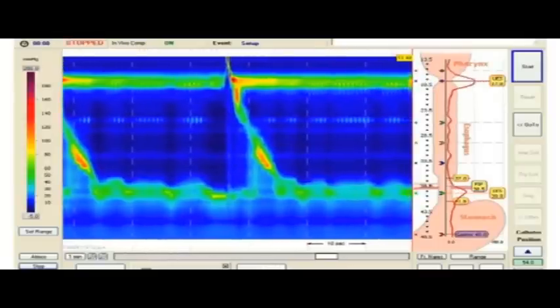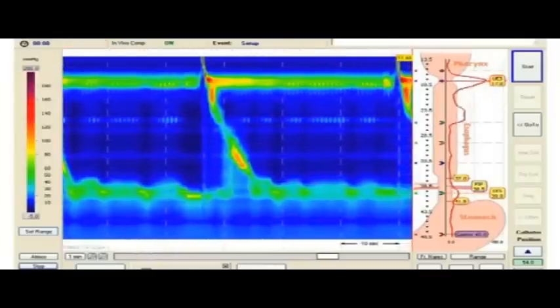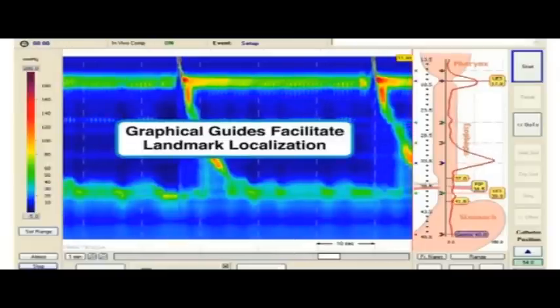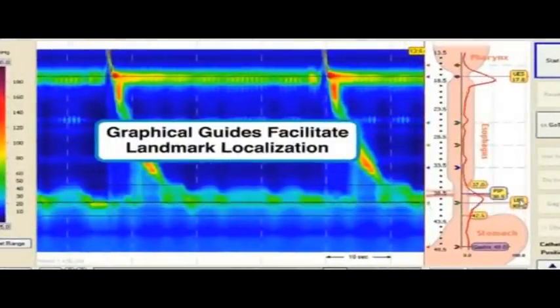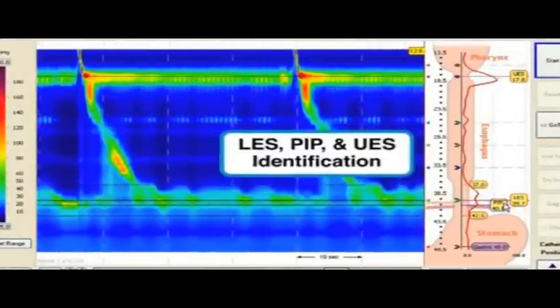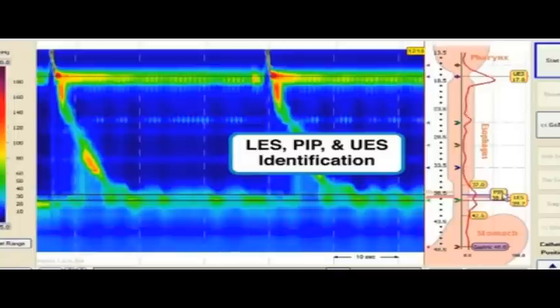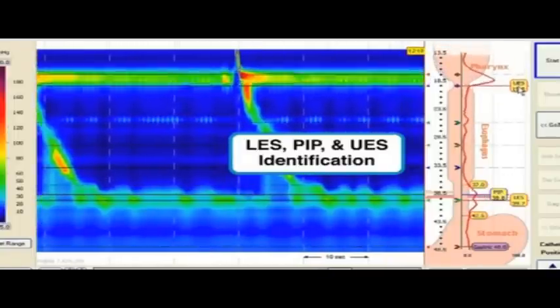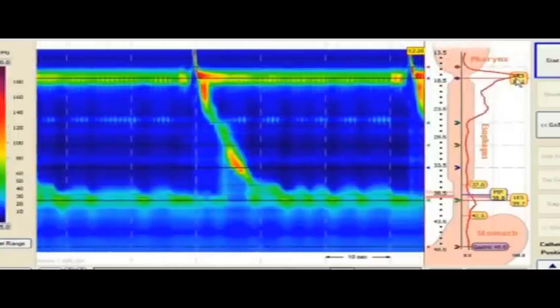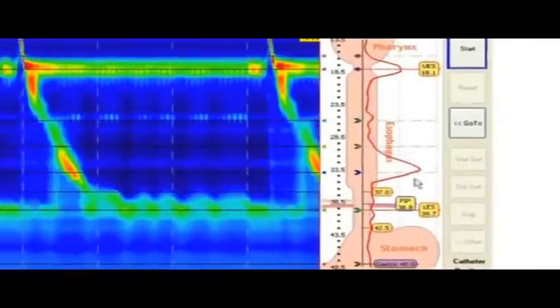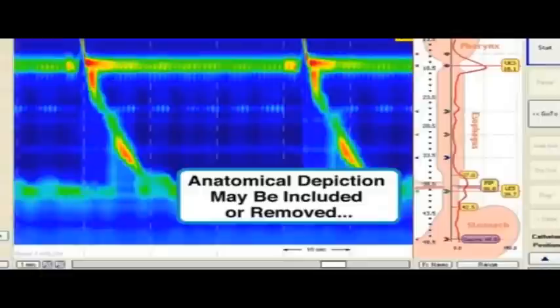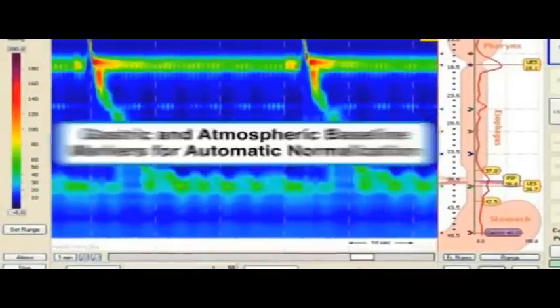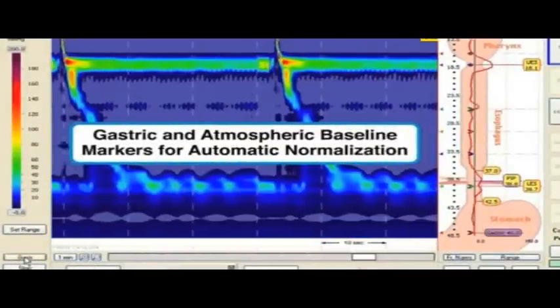ManoScan employs intuitive new tools to assist the procedure and data analysis. Graphical guides facilitate localization of anatomical landmarks. The LES, PIP, and UES are readily identified so that data may be analyzed at their true locations. A graphical depiction is available that superimposes pressure on the anatomy, and the data may be displayed relative to gastric or atmospheric baselines.